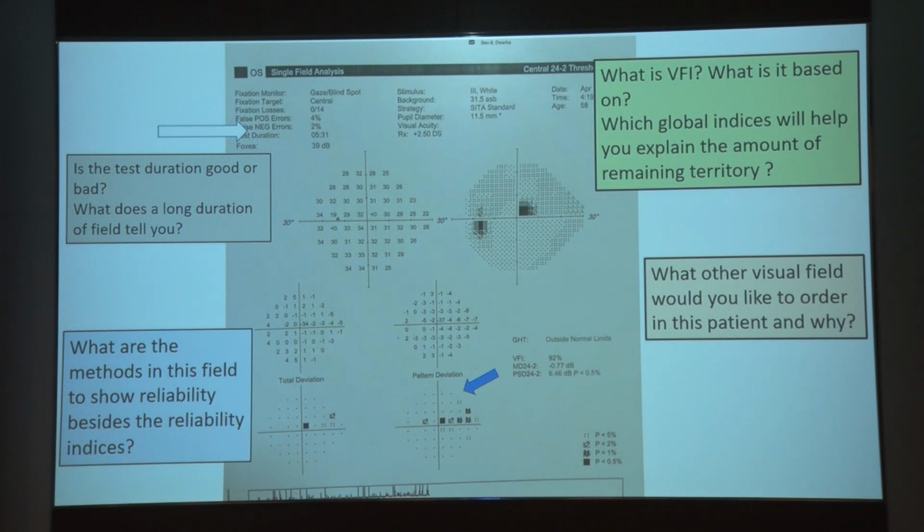Come down. Go home and check. I will not tell you everything here. Okay? Don't go on the total numbers. In 10-2, how many total points do you have in 10 degrees? At least 10 times more points than this. All right?